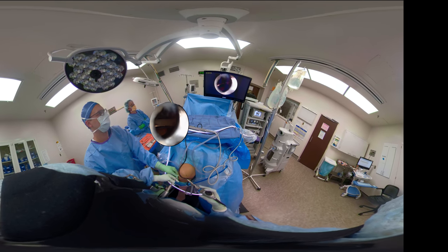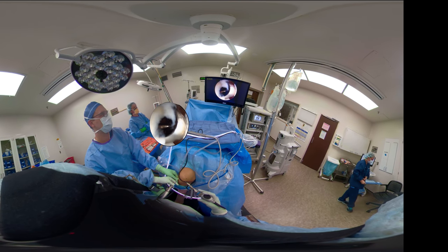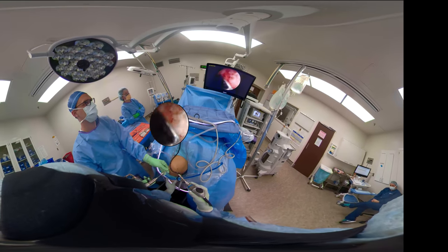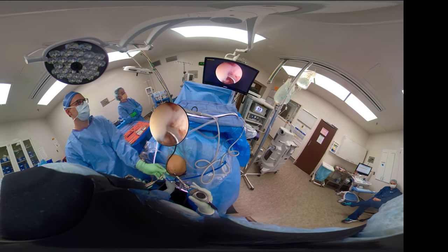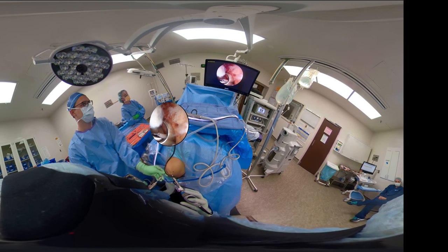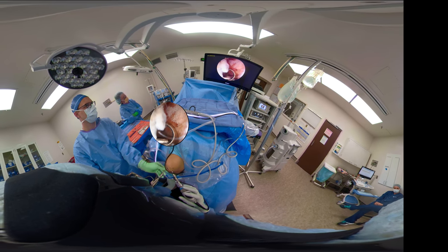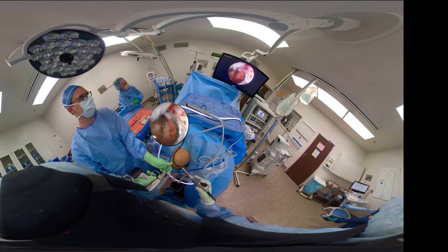Again, another microfracture poke hole made, and you can see where we're controlling the drill, looking down at how the depth is. And you can do this freehand, but you've got a pretty small drill bit, so you don't want to bend the drill bit. So it's a little safer to have some type of a cannula. It can be a plastic disposable cannula or this cannula was working well. And again, I'm keeping my eye on the defects so we can keep track of the number of microfracture passes that we've made.